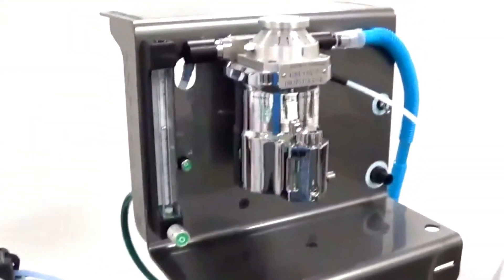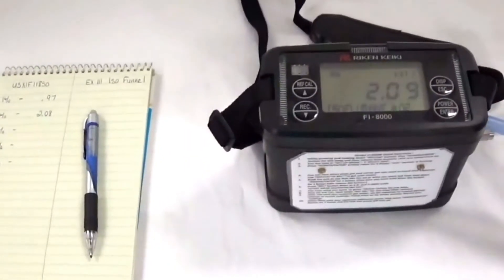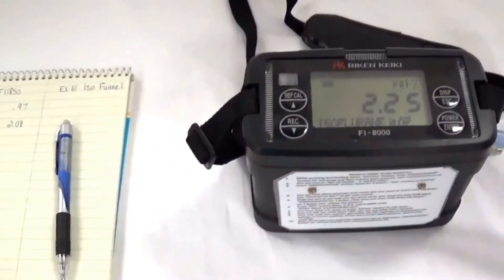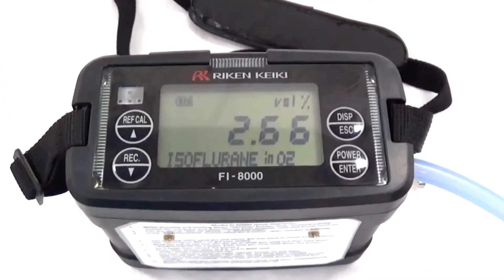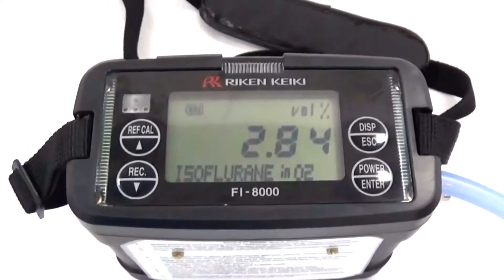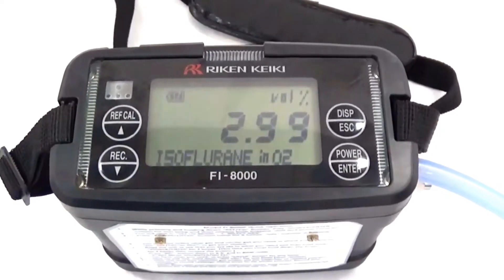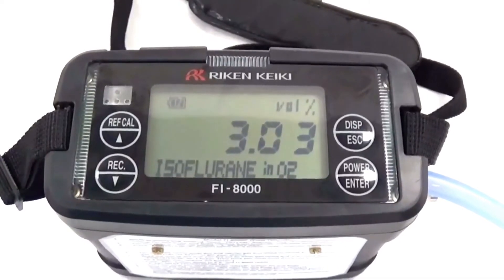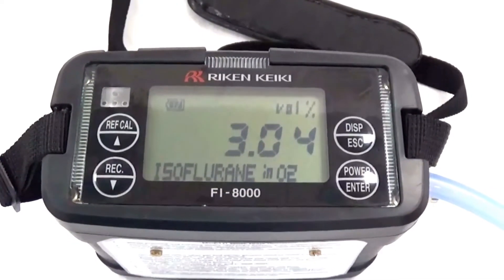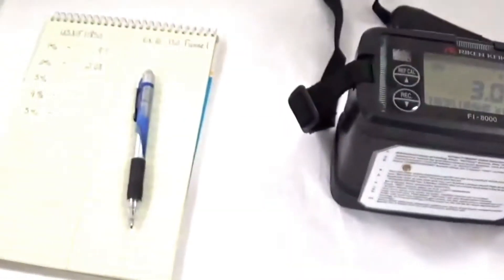We will now adjust the vaporizer to 3% and verify the readings. The numbers are slowing down. We are at 3.04, 3.05. We will record 3.05%.